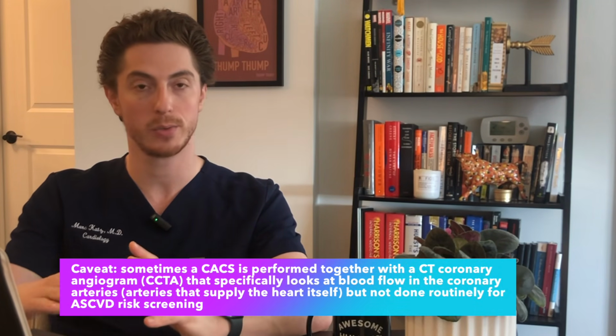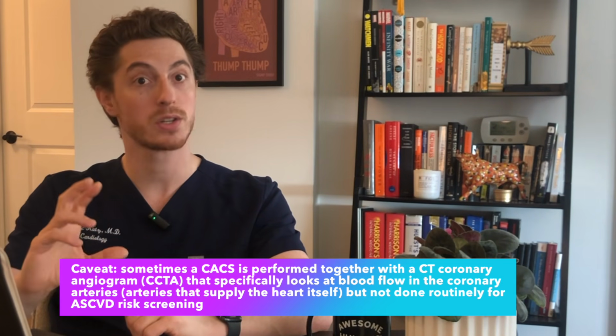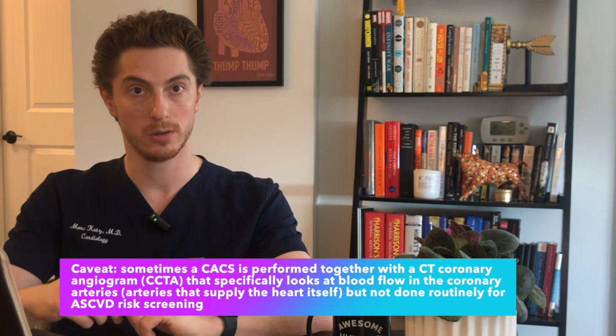We're just looking at the calcium, so we are unable to see what the blood flow in the arteries of the heart looks like. A coronary calcium score of greater than 400 is quite abnormal, but it doesn't go right up to 400. You can have up to thousands. I've seen patients with coronary calcium scores of 1500 and way higher.